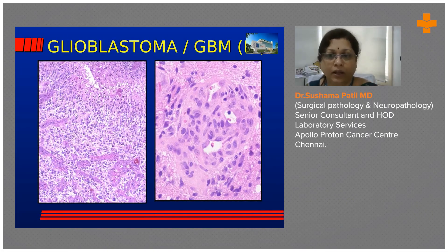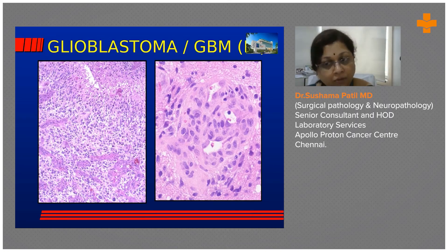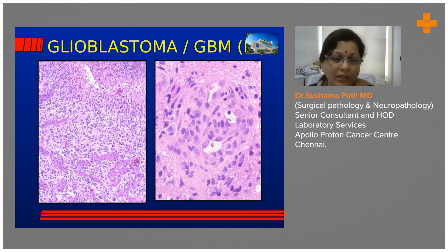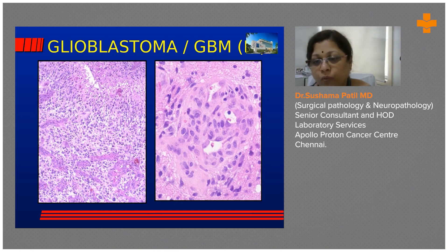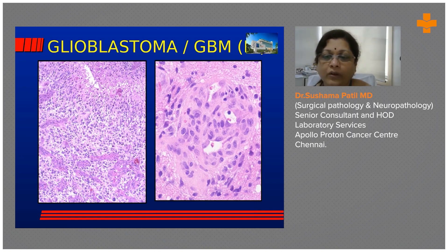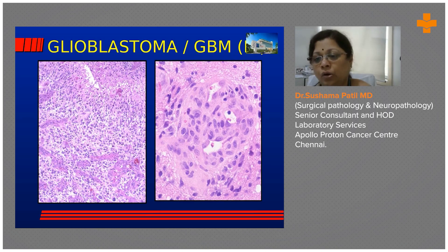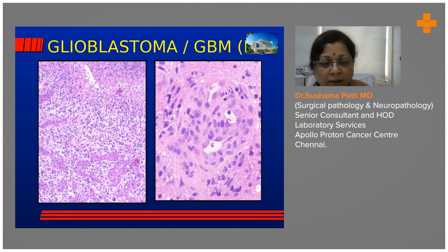Next we're coming to the glioblastomas. High grade gliomas are defined either molecularly or conventionally by the presence of endovascular proliferation and necrosis. On the right hand panel, what you're seeing in the circle — with few red cells in those empty spaces — that whole structure is endovascular proliferation, which mimics a glomerulus, so we call these glomeruloid vessels.